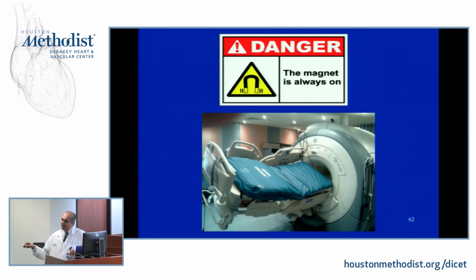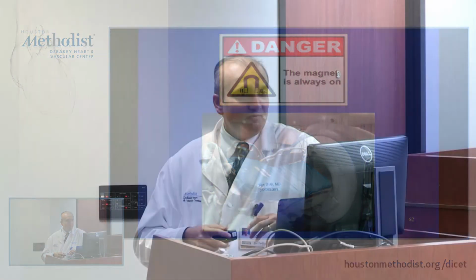The second thing to keep in mind is that if you're not sure if it's ferromagnetic or not, it's best to not take it into the room until we test it out. So we have a local magnet outside that we can test anything to see if it is ferromagnetic or not. And the third thing is that the magnet is always on. So even when the lights are out and everybody's gone for the day, this magnet doesn't come down. If it's a 1.5 Tesla magnet, it always stays at 1.5 Tesla.